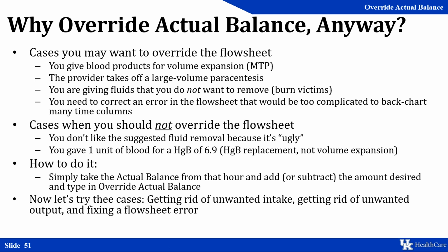Cases when you should not use the override actual balance: if you don't like the suggestion just because it's ugly, you want to make sure that, one, it's accurate, and if it is, you need to start working to chip away at it. If it's not realistic to pull that much, have that conversation with nephrology.